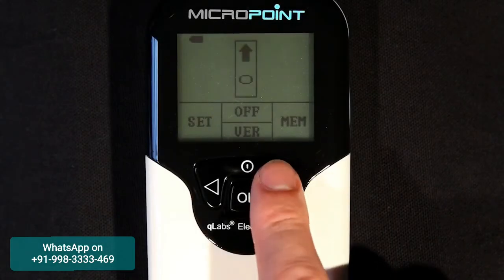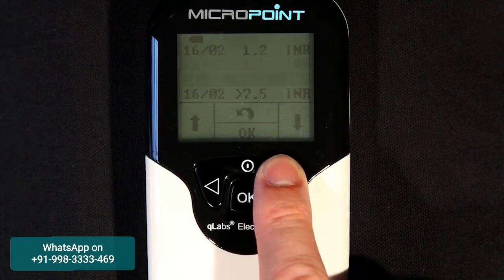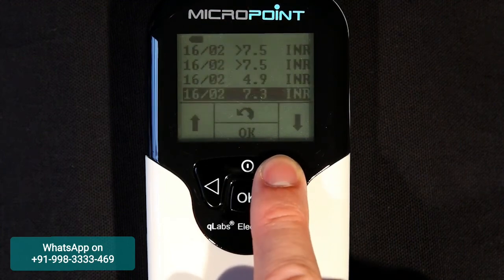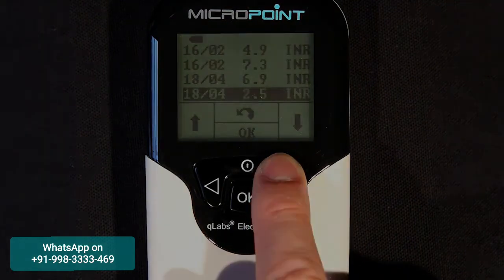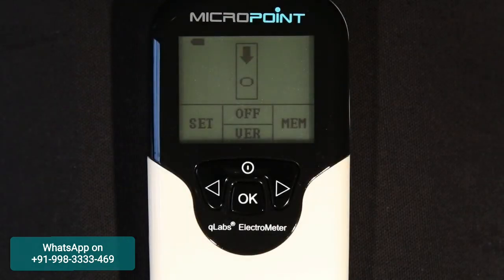Test results are automatically stored in the Q-Labs Electrometer memory. The unit can store up to 200 results, and if the memory is full, the new test result will overwrite the oldest test. When data has been acquired, press the OK button. The meter will then prompt the user to remove the test strip and will be ready for the next test.